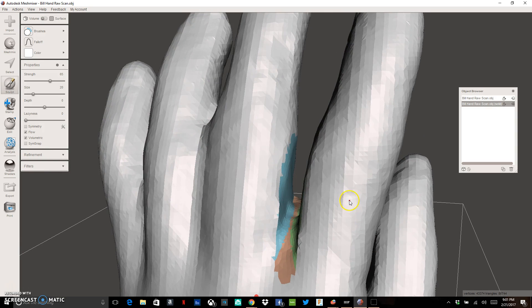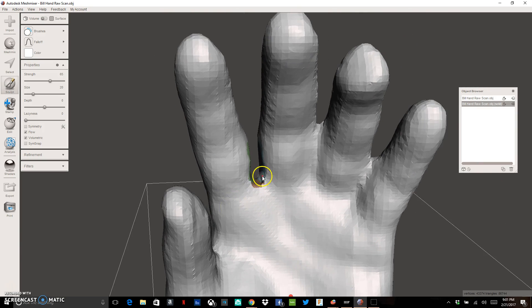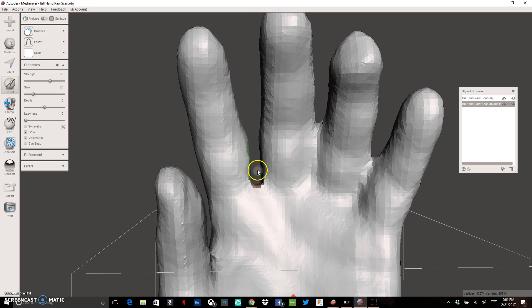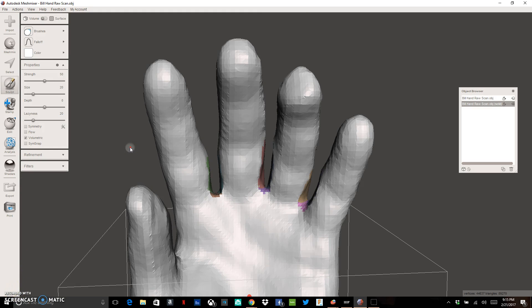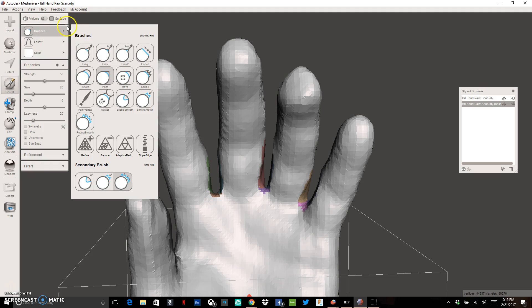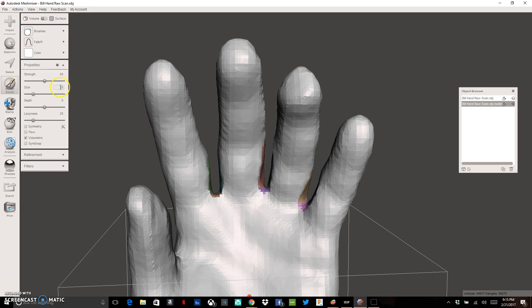I'm doing sculpting to make these hands look a little bit better and more realistic. I'm going to pause here and follow the same exact process to get rid of the webbing on the other two fingers, and then we'll come back and show you how to add some detail. To add detail, we're going to use our brushes — instead of the Robust Smooth brush, we're going to use Pinch. I want to change the settings: Strength up to 100, Size at about 20, Depth all the way up, Laziness at about 20, and I want to turn the Volumetric option off.